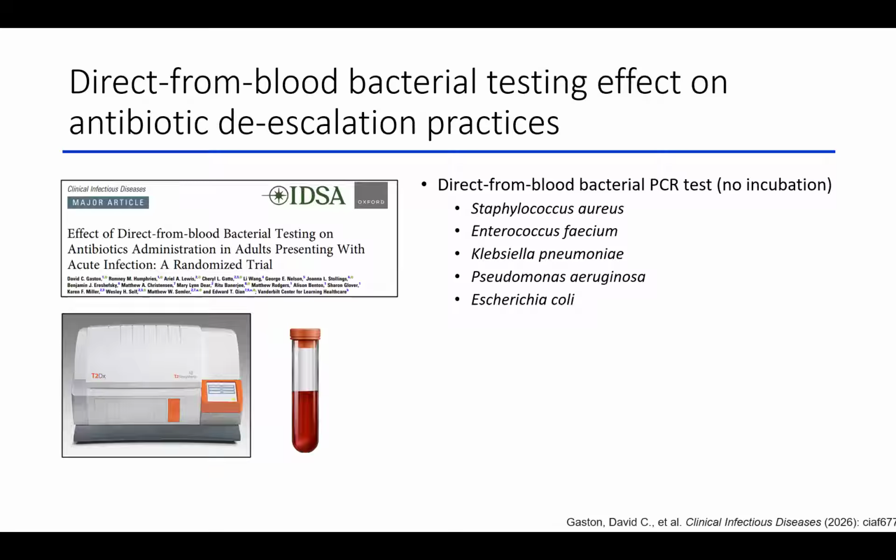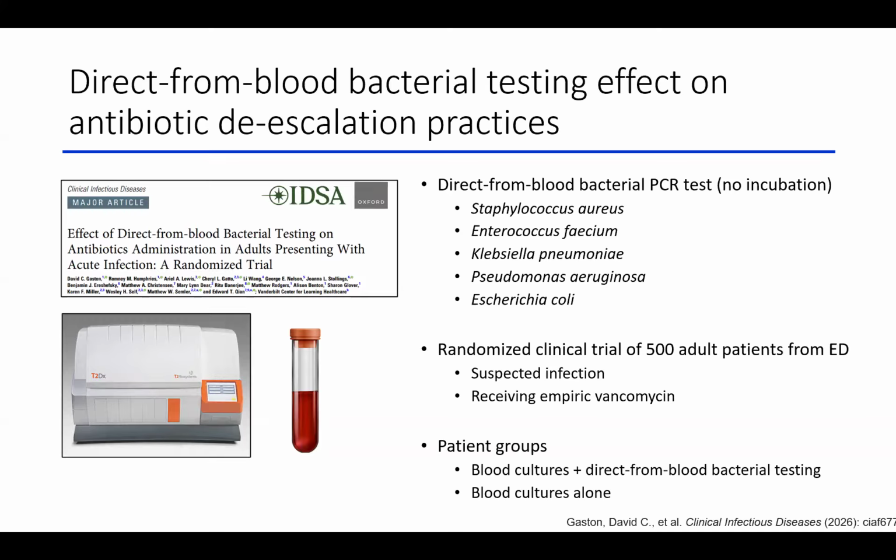And yes, this company has been liquidated, and no, you can't just use other reagents or whatnot. As soon as you run out of your reagents, you are done. You can't change a tube without being out of FDA compliance. So this is not one that's currently available, but I thought it was a good study because of how well it was done.